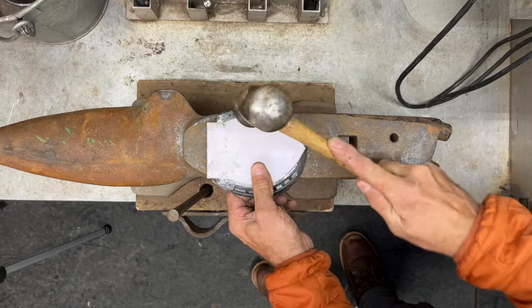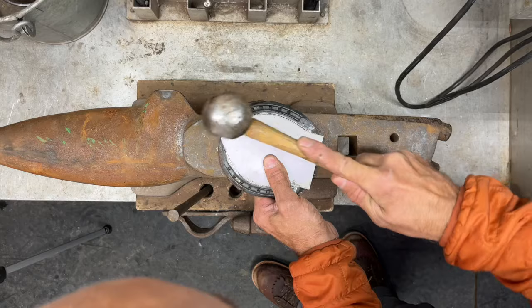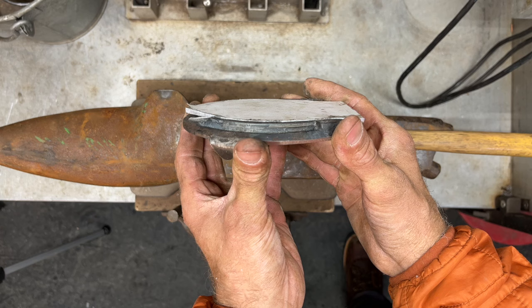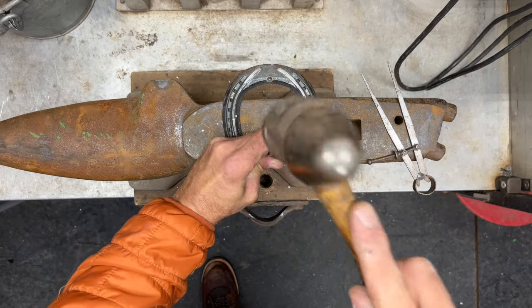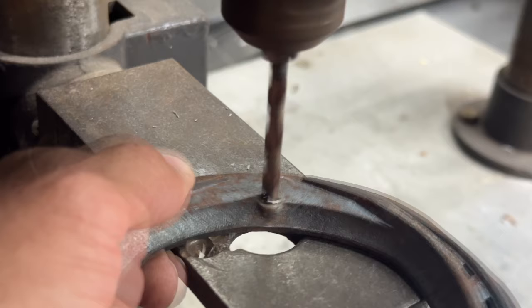It should now fit pretty snug between the inner rims of the Avanti shoe. We are now ready to drill and tap the shoe and plate. I chose to do just two holes for this shoe; however, I used three holes with the shoe that I nailed on the horse. I used a quarter inch tap and a 13/64th inch drill bit.